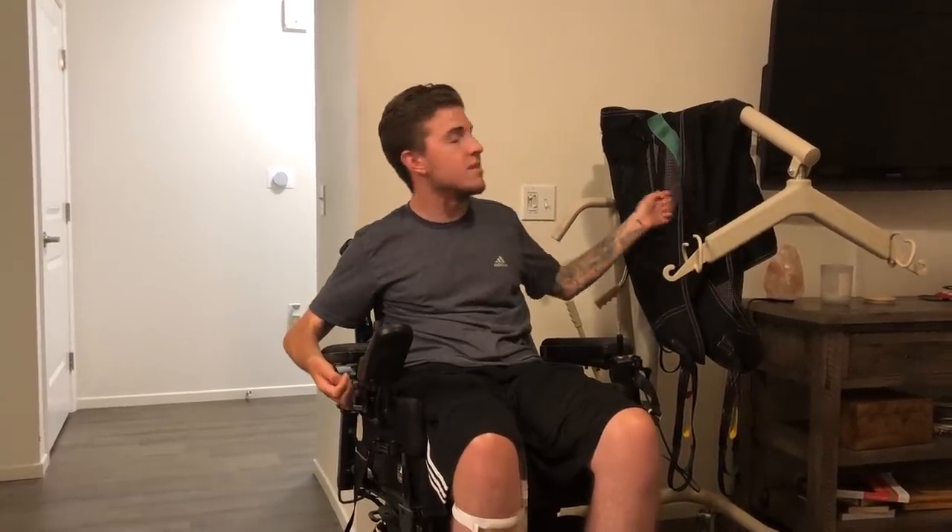Hey guys. So Bri and I ended up not recording our nighttime routine the other night — hence me being in different clothes. It ended up getting too late, so we decided to do it tonight. This is the Hoyer Lift that we got with all of your donations. Bri and I both want to thank everyone that donated to help get this. It has been making our lives so much better and it's helped a lot with Bri's back. So this is the sling that it came with, and I'm going to show you how Bri gets it behind my back and underneath me, and how she hoists me in the air and gets me in my bed.